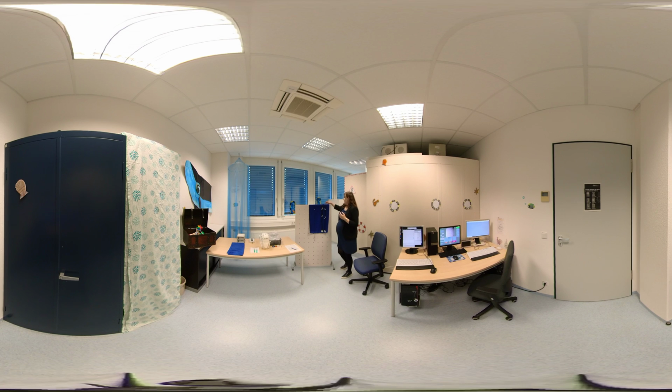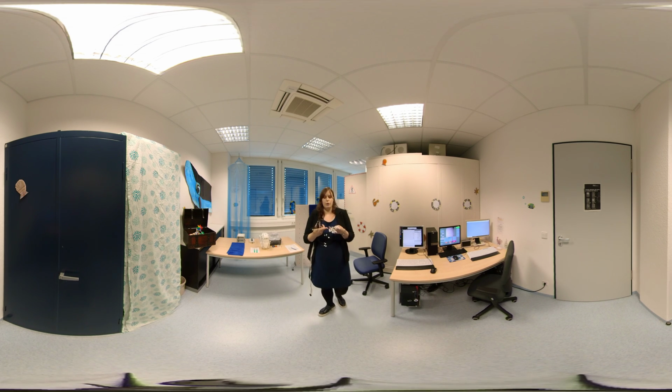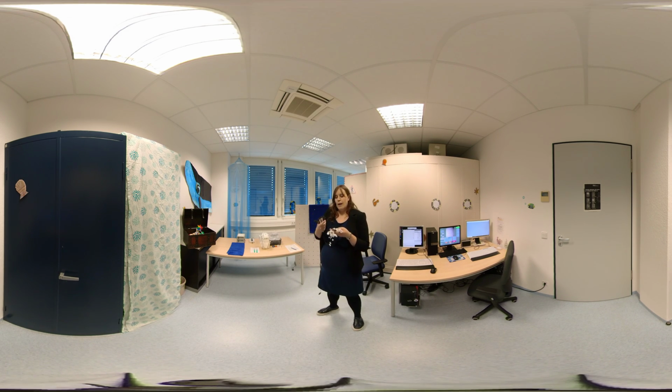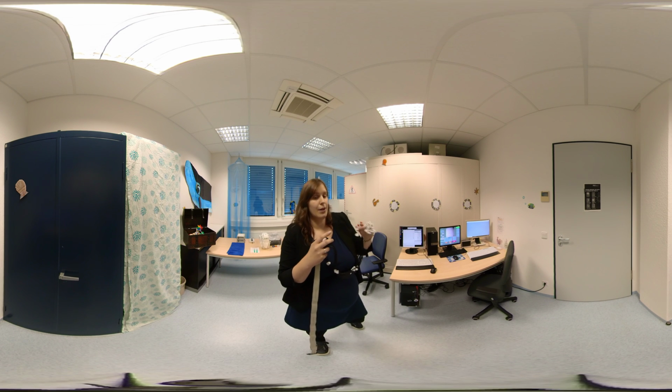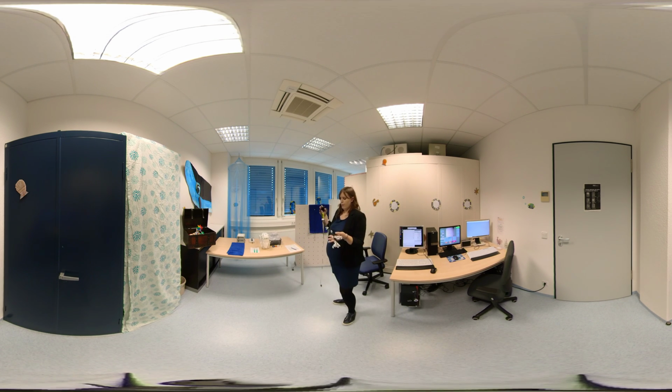You can also already see our electrodes hanging over here. Electrodes are the sensors we use to measure potential changes from the head surface. And these electrodes are so-called active electrodes. When we measure a signal from the brain, the signal is very small compared to all the other signals in the environment. The active electrodes contain a little computer chip that allows the electrodes to amplify the signal as soon as we measure it from the head, which makes it easier to measure the signal.